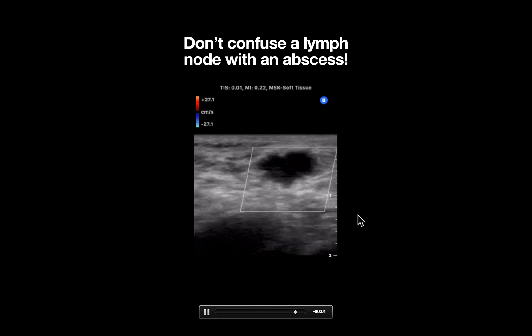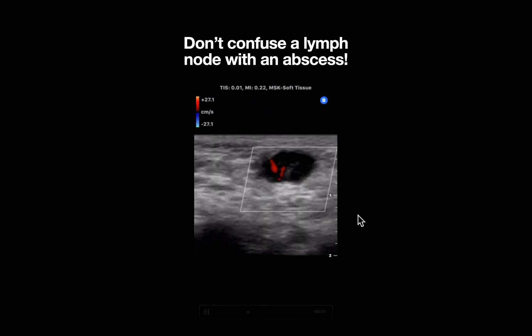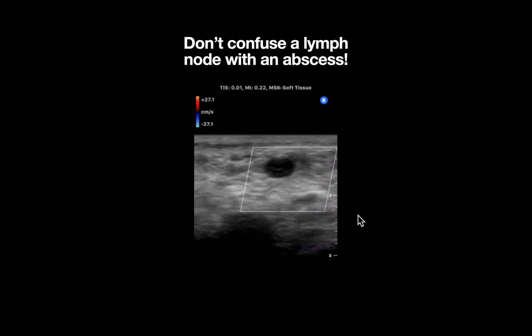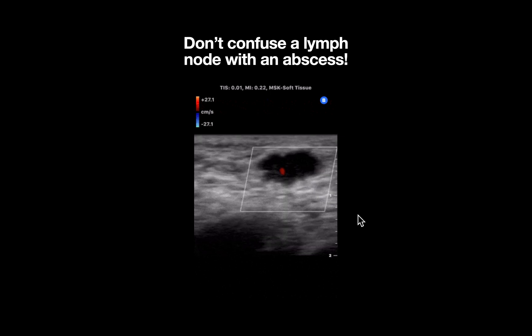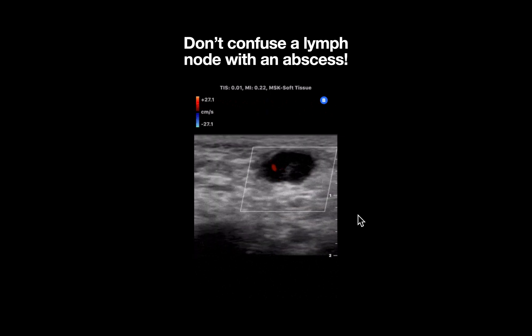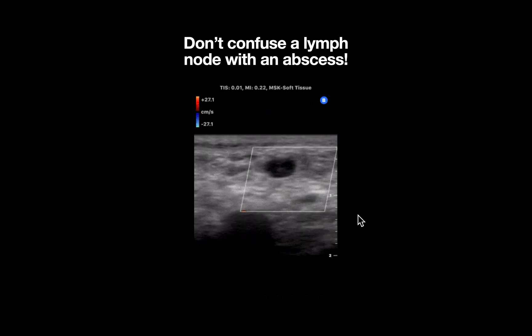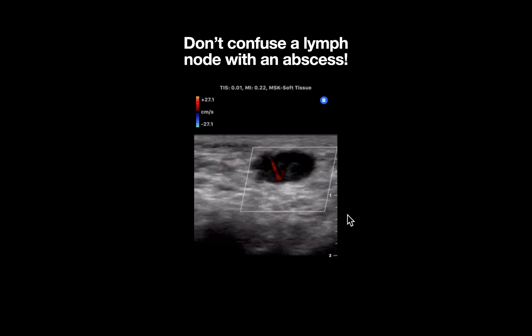It's important to be able to recognize a lymph node when evaluating a soft tissue infection, especially over areas such as the axilla, groin, and neck, to avoid unnecessary incision and drainage.